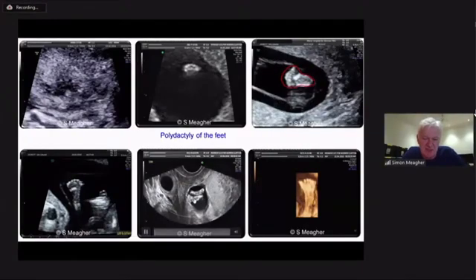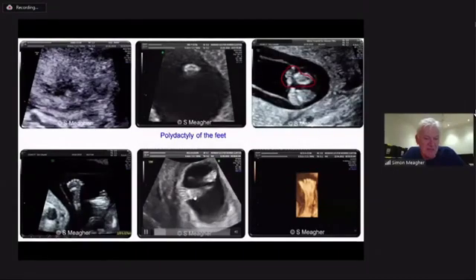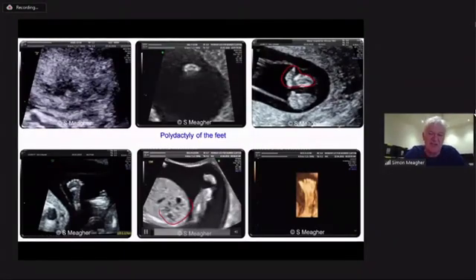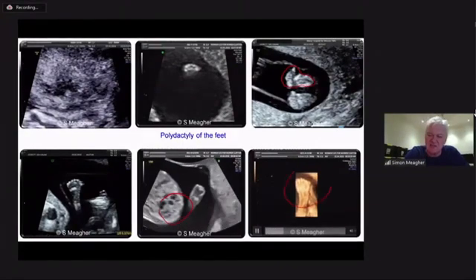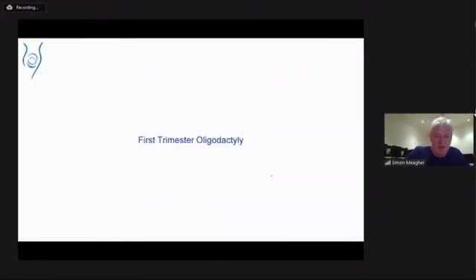And in this situation here, if you ever see an encephalocele, remember to look at the digits of both hands and feet, because of polydactyly of the feet and hands. This is a fetus with Meckel-Gruber, and you can actually see the cystic kidneys here. The kidneys are the most pertinent finding in Meckel-Gruber, the most consistent finding, but this fetus also had an encephalocele, and this is a 3D rendered image of the fetal digits. So I'm saying it's difficult, but it's possible.